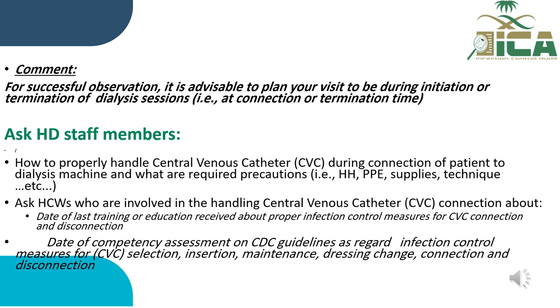Ask healthcare workers who are involved in handling central venous catheter connections about the date of last training or education received about infection control measures for central venous catheter connections and disconnections, and the date of competency assessment on CDC guidelines regarding infection control measures for central venous catheter insertion, maintenance, dressing change, connections and disconnections.